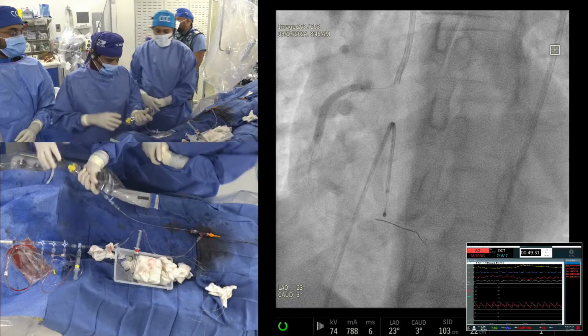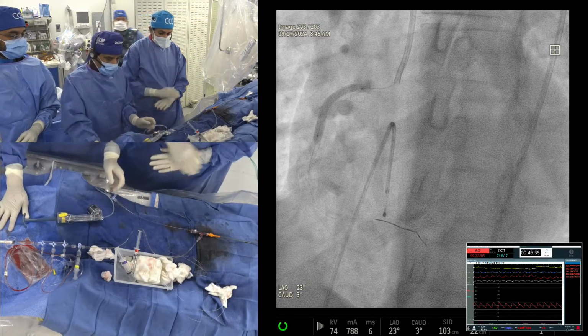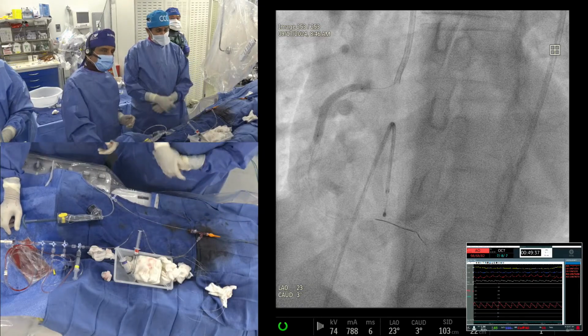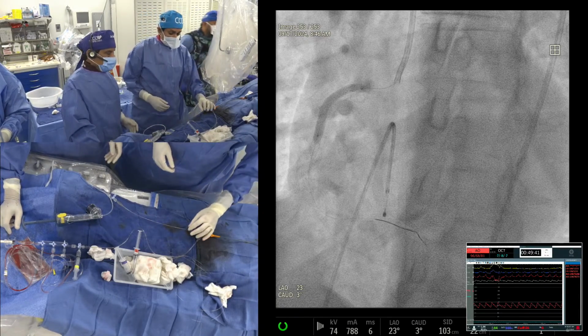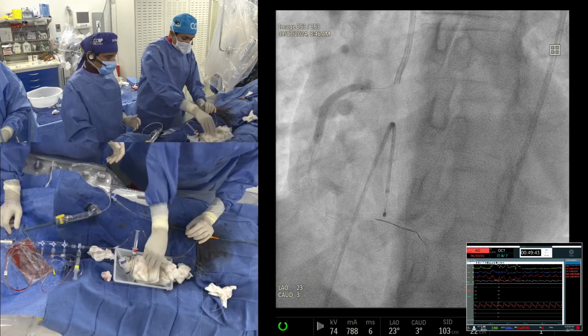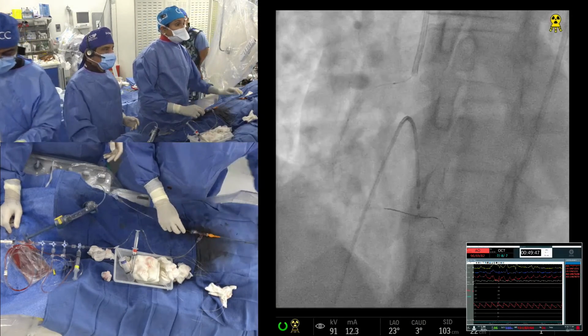Having a pacemaker is like having an Impella in LV dysfunction. Because if this patient really had a slow flow and we consistently had to give verapamil, other vasodilators, hypotension, all this, then you definitely need a pacemaker.